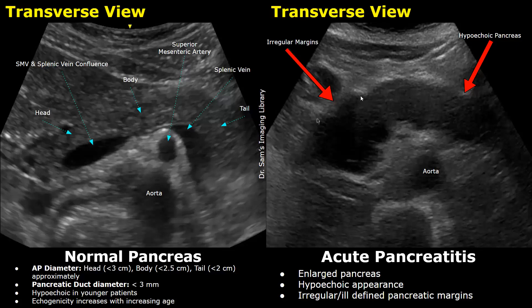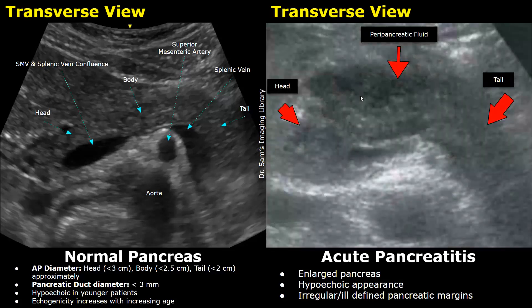In this image, you can see a heterogeneous, enlarged pancreas along with hypoechoic peripancreatic fluid. The pancreas has irregular, ill-defined margins.